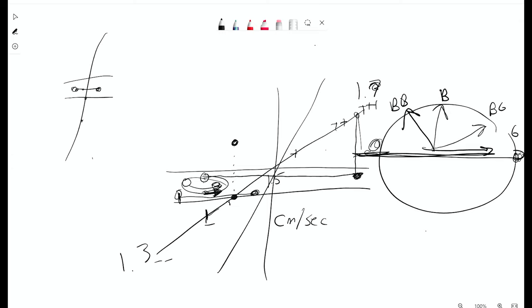because we're looking at vessels. The vein does not have anywhere close to the Venc that the artery has. Right, it's not going nearly as fast. So do like a 10, or like a 12, something like that. What you really want is bright vessels. You don't want grays, because grays in this case mean that your Venc was much too high.